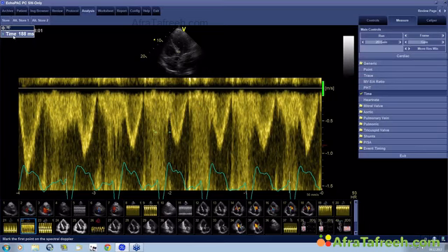This, what you have here, is the so-called aortic electromechanical delay. And the cutoff value is 140 milliseconds. A normal patient might have maybe 80, 70, maybe 90, but certainly not more than 100. If this value exceeds 140 milliseconds, you can be quite sure that there is a significant degree of desynchrony.